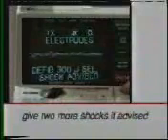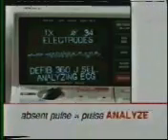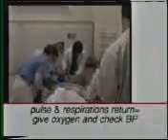Press the Analyze button immediately. Give 2 more shocks if advised. If the pulse is still absent, perform CPR for 1 minute. Check the pulse. If absent, press Analyze. If indicated by the ZOLL 2000, deliver 3 more stacked shocks. If pulse and respirations return, put oxygen on the patient, check blood pressure, and prepare for IV insertion.